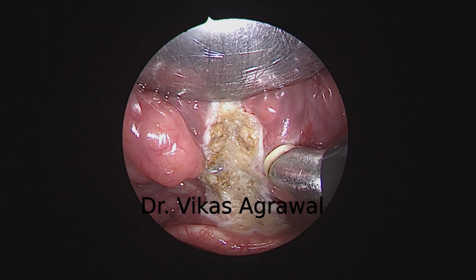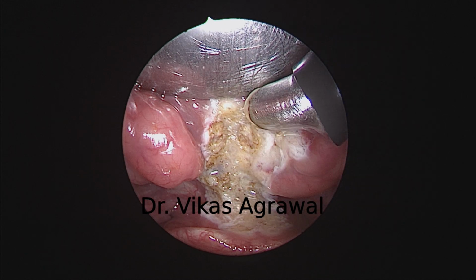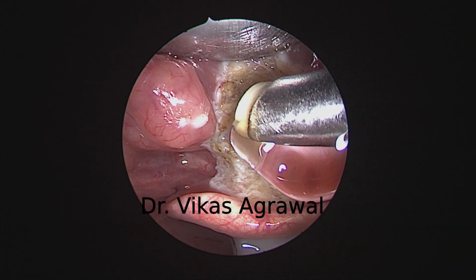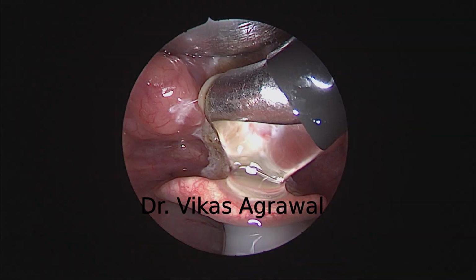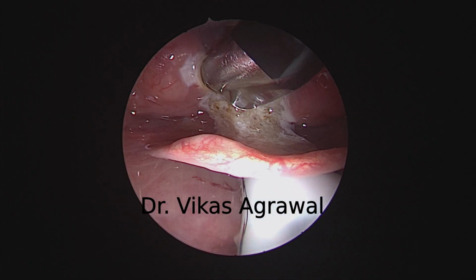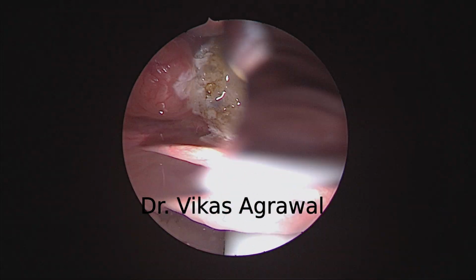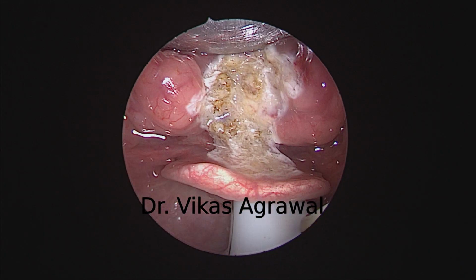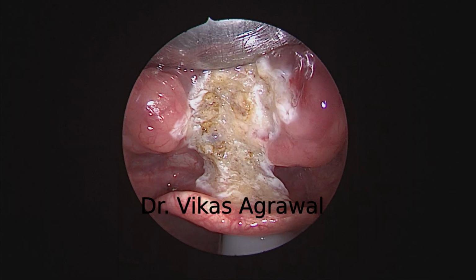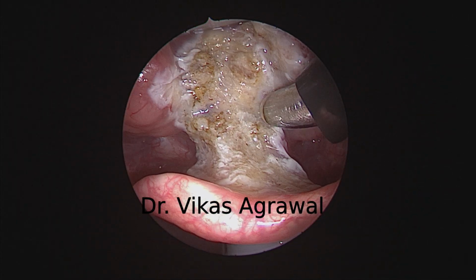I may just do a little bit of coagulation more, because this was a primary epiglottic collapse. This is not a tongue-base collapse. You do not need to do too much. Only a proper glossoepiglottopexy should be good enough. So that's the final result, and hopefully this patient will not require any PAP therapy, any other therapy for his epiglottis.